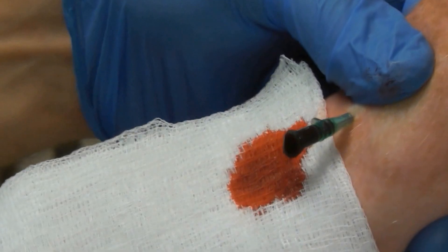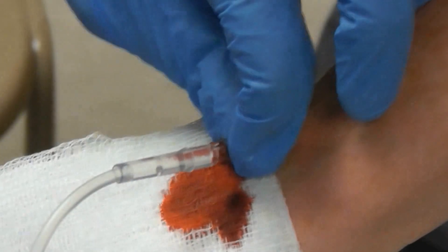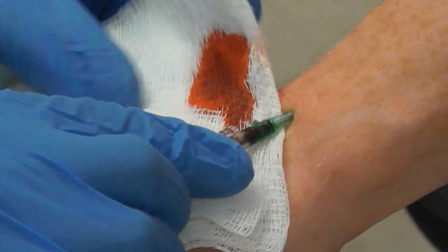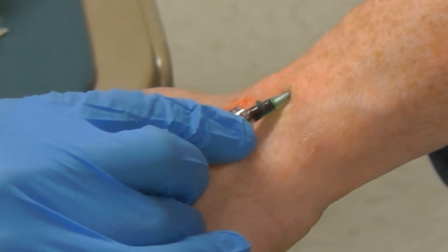See, that's where the gauze is for. I set this syringe off to the side. Now I can hook up my saline lock. I was able to do that with zero mess. Now I can put my tegaderm on.